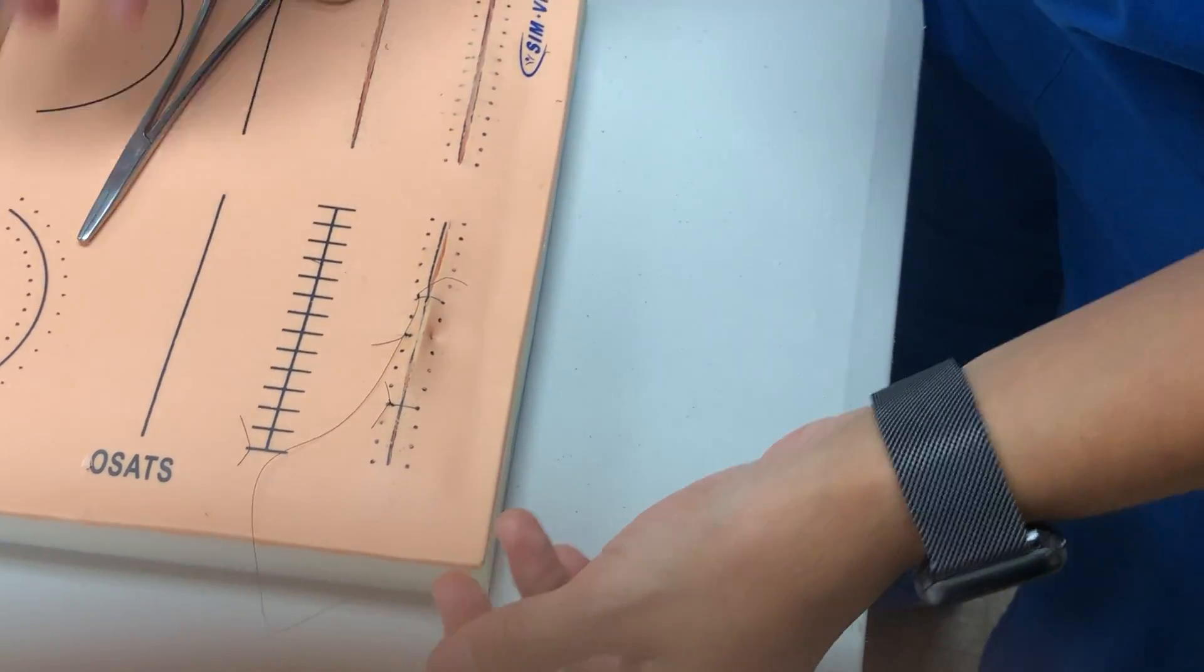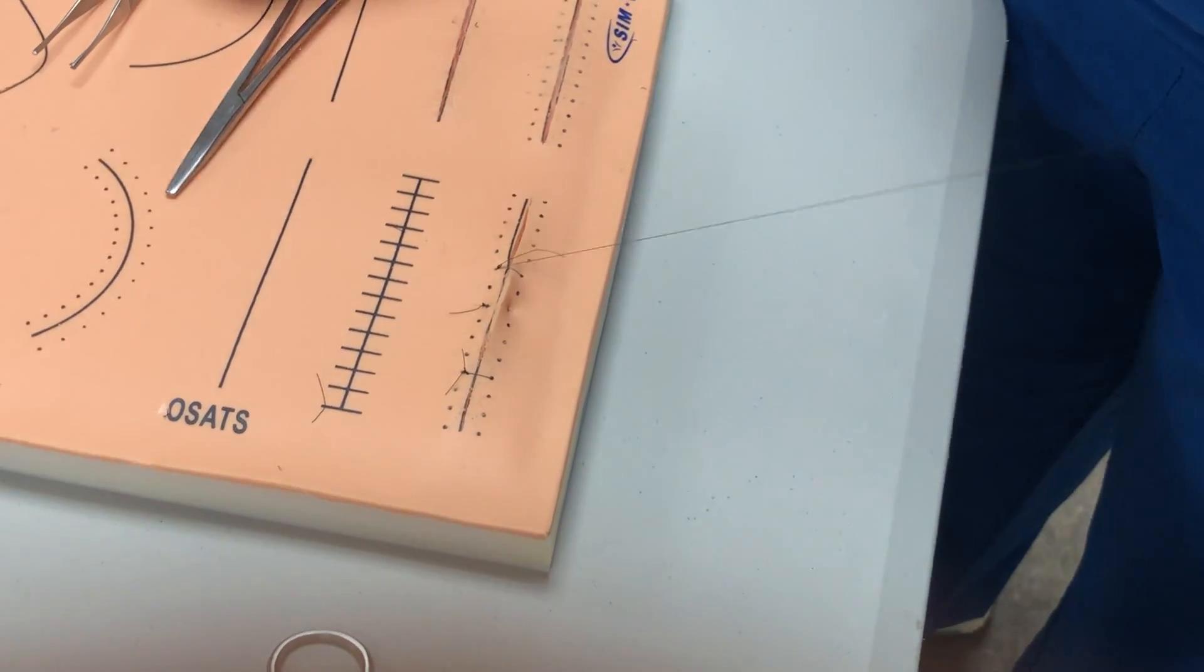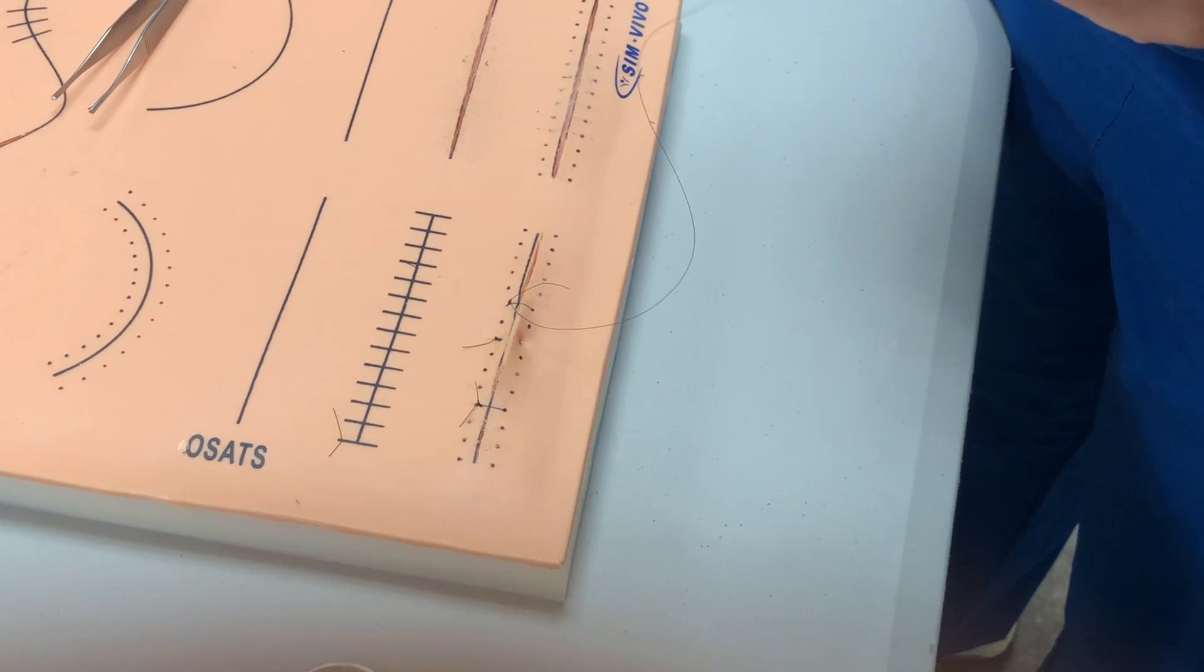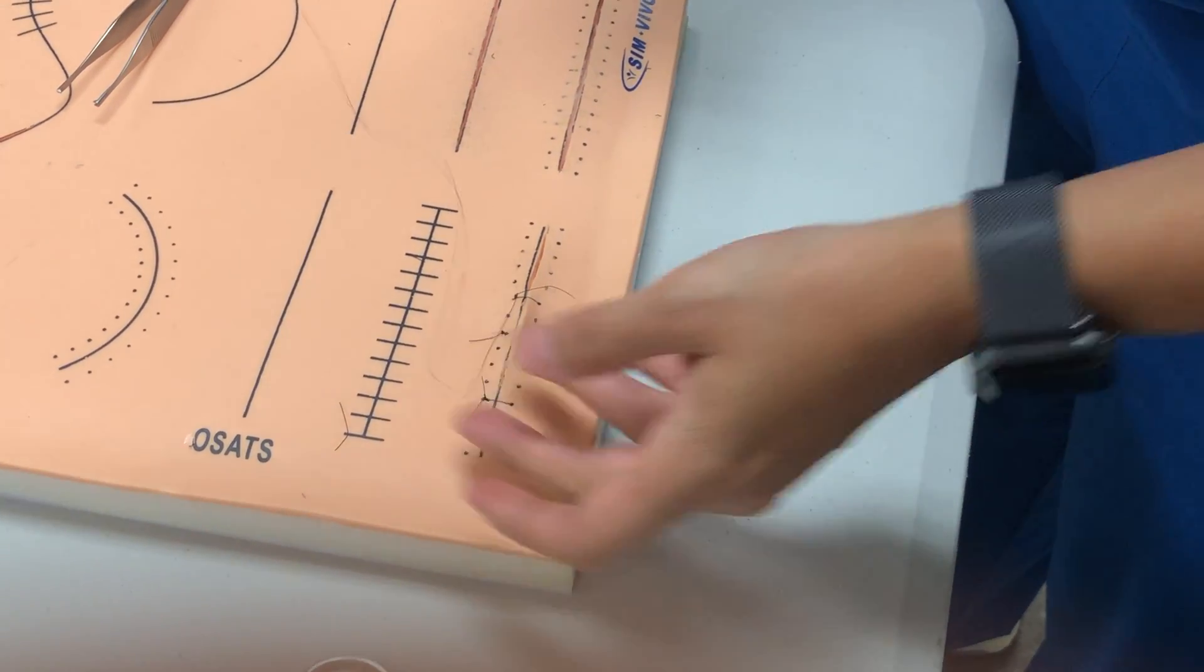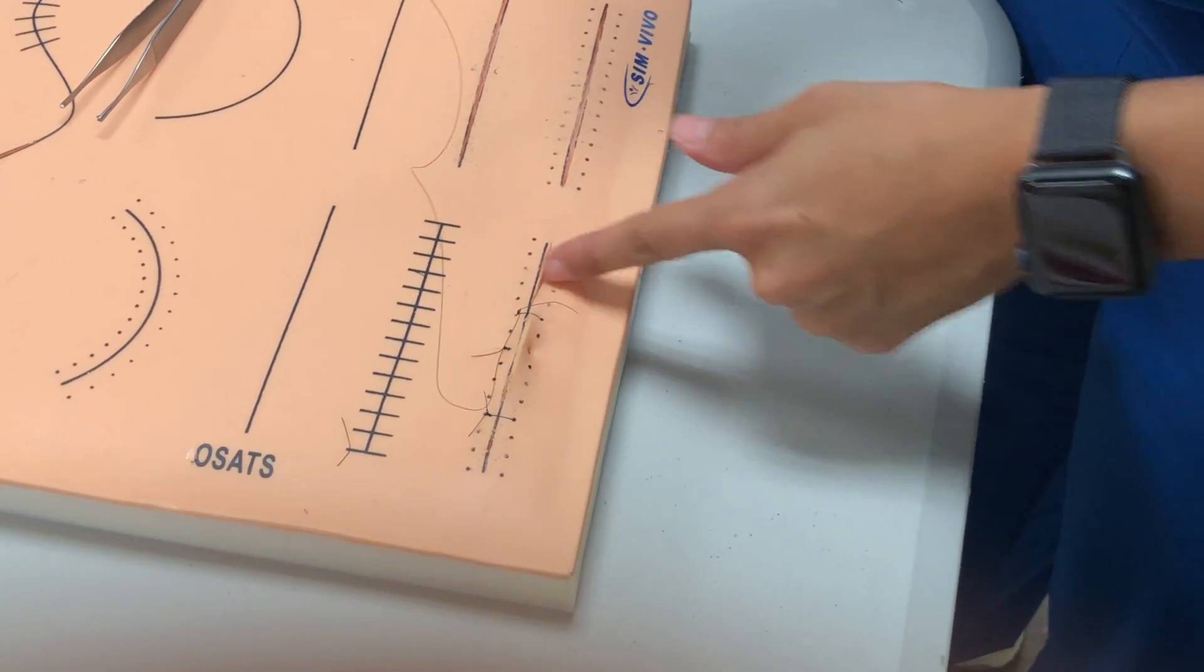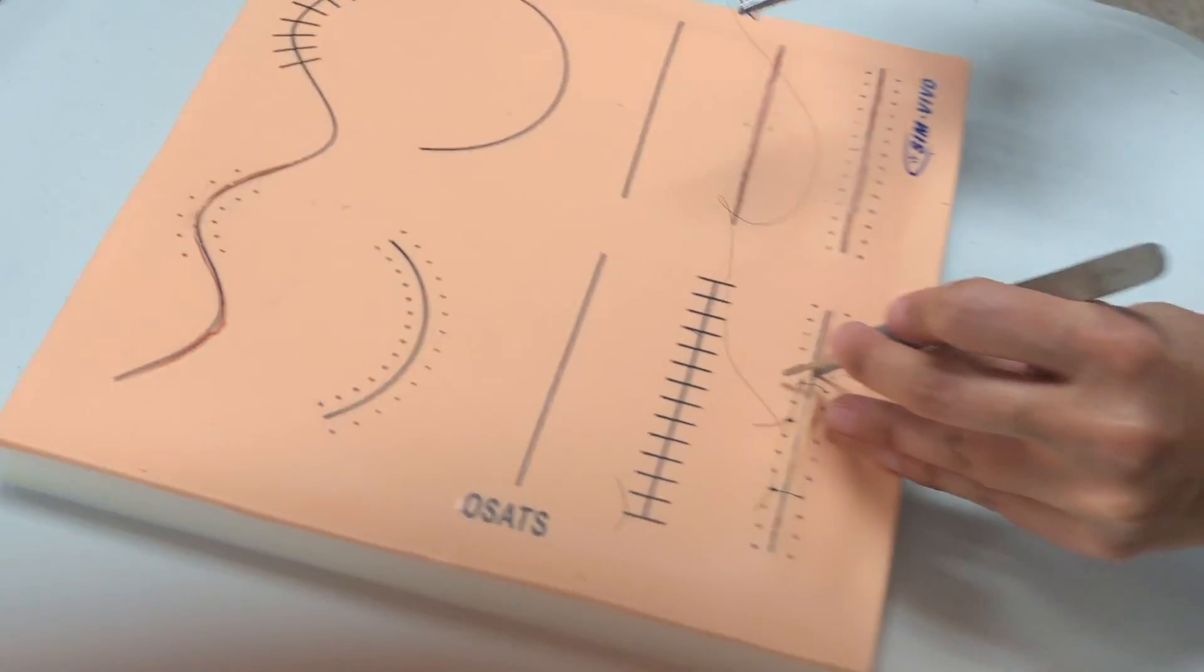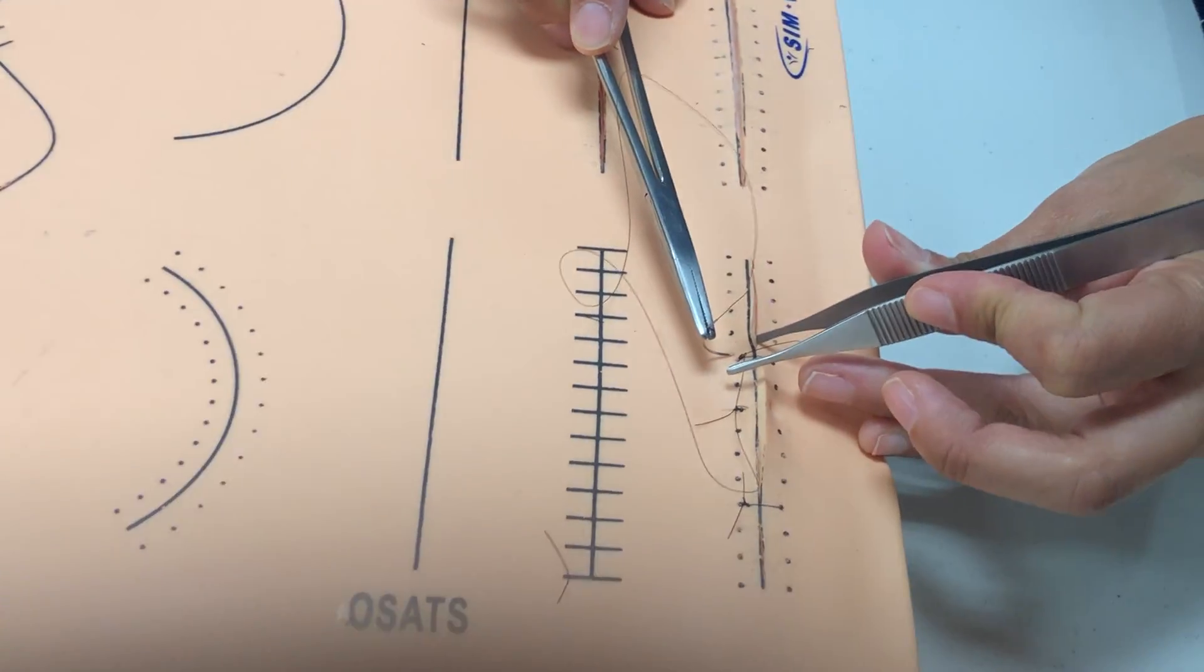Alright, so we're going to leave it like that. We're not going to cut it and now we're going to go underneath to kind of hide our knot so that we can have our stitches running parallel to each other. So when we go in on this one, we're going to go in right next to the knot.